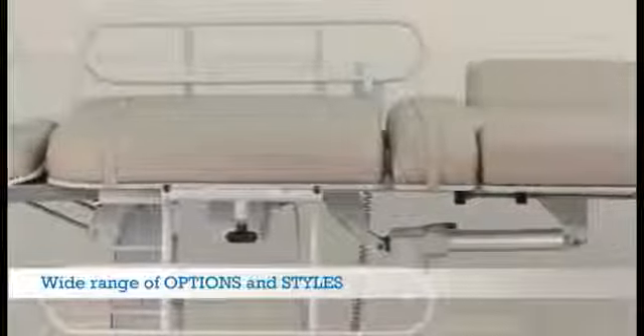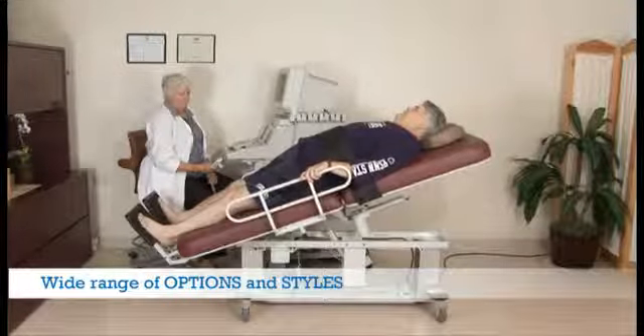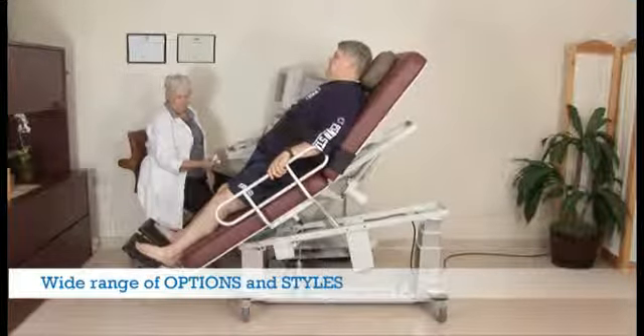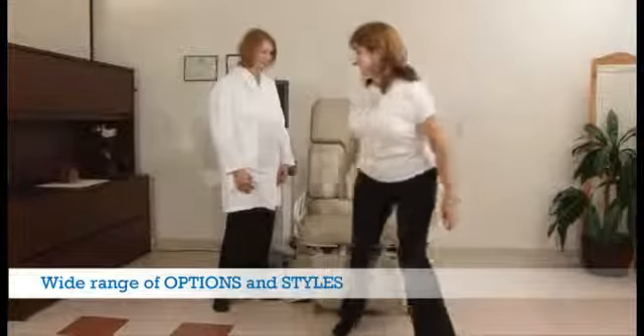We offer a wide range of options and styles — from our fully featured multi-purpose table that can do just about everything, to our vascular table with 40 degree tilt and powered fowler that achieves a nearly standing position.